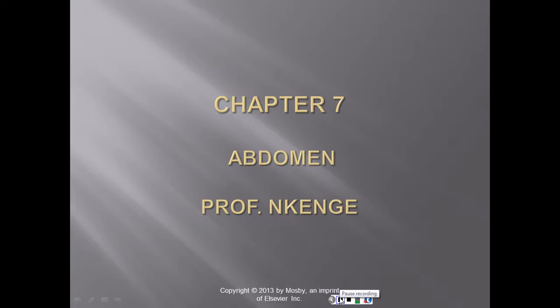Please have your textbooks open to Chapter 7, page 397. We will be discussing the abdomen. The abdominal cavity houses many critical structures that have a large array of functions. It is for this reason that cross-sectional imaging of the abdomen is so essential in visualizing these various organs and body systems. This is image 7-1.